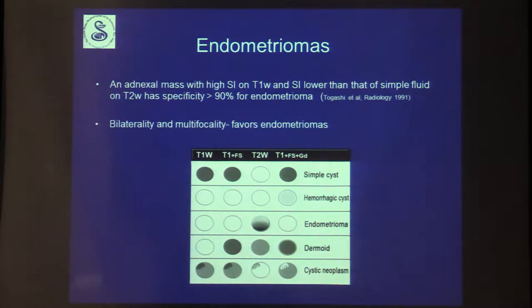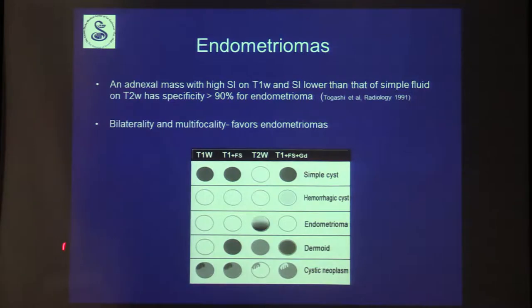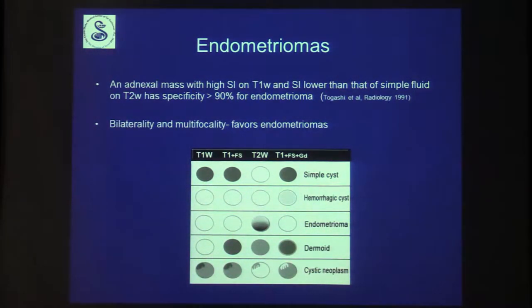If endometriomas are bilateral or multifocal, that further favors endometriosis. A graph demonstrates the differences between the various cystic lesions of the ovary.